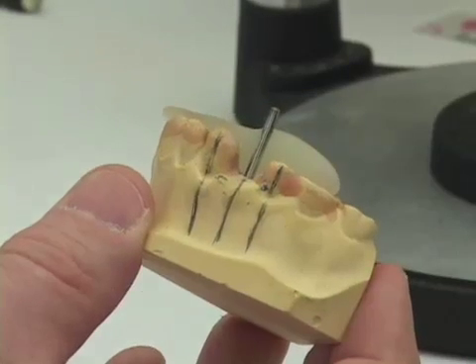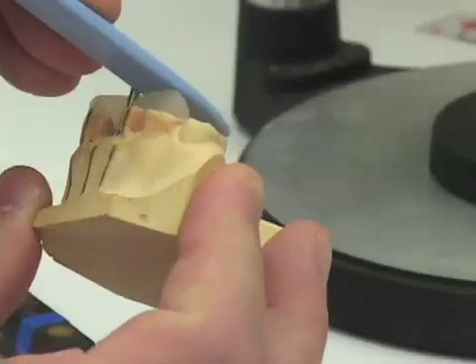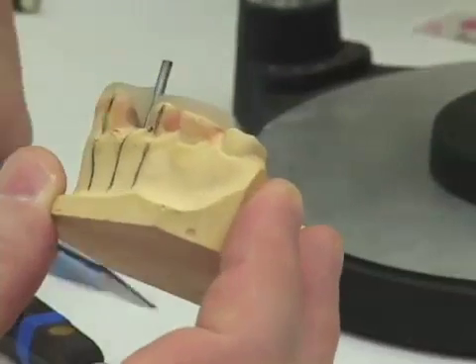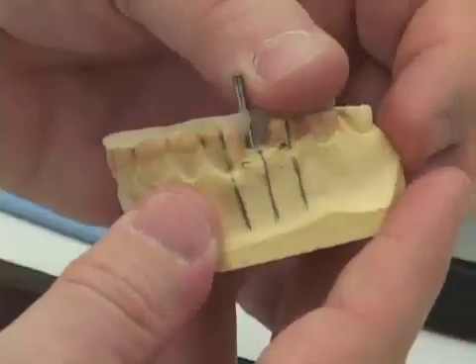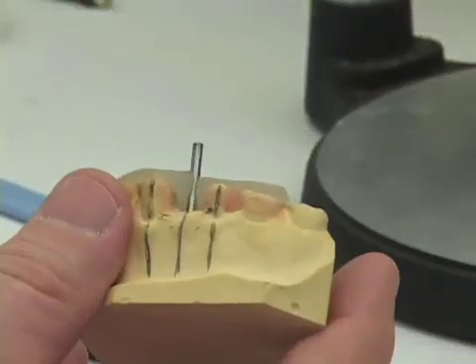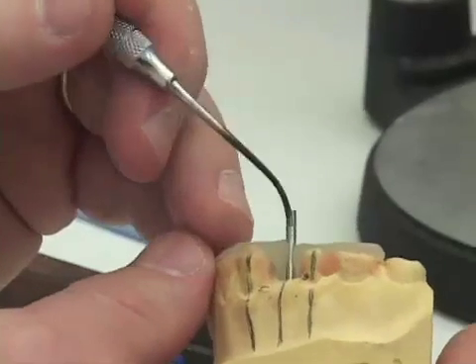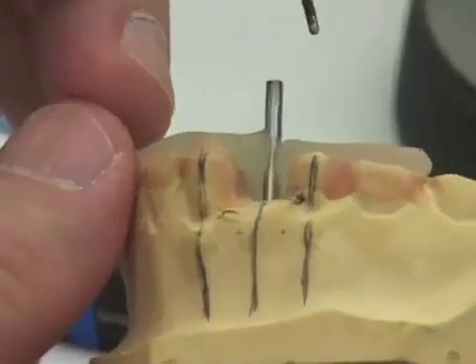I can also take either a buffalo knife or the handle of my scalpel — my 11 blade — and press the triad down toward the occlusal surfaces of the teeth, adapting it very well at the occlusal and thoroughly at the lingual. When viewed from the buccal, I want very good adaptation at the lingual 180 degrees of the drill blank.